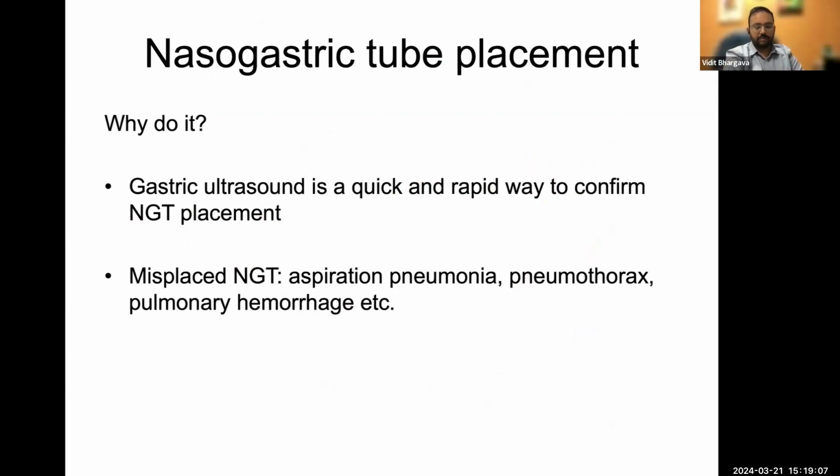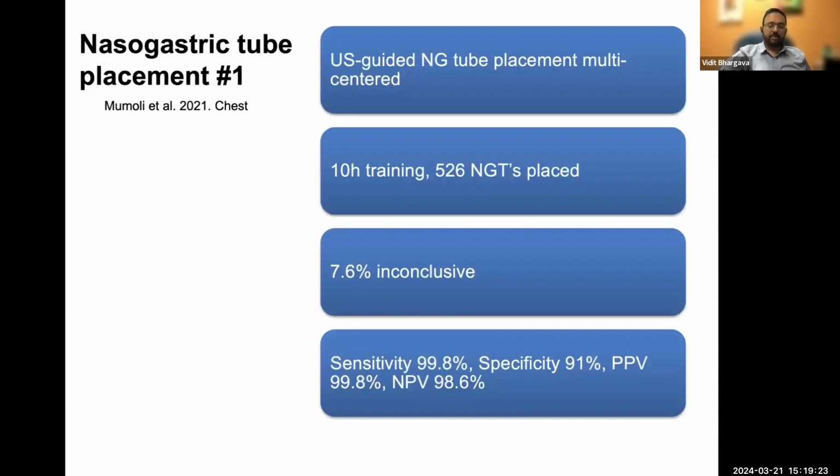It is a quick and rapid way of confirming. There are a few studies which have demonstrated its efficacy. And we know that a misplaced nasogastric tube can cause a few different complications, so confirming it with a safe and easy test is obviously helpful. The protocols that we're going to discuss come from two different studies.